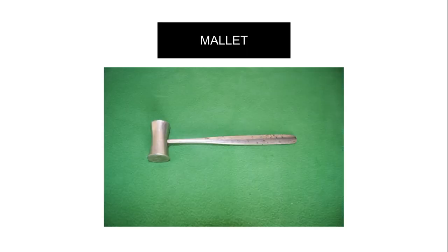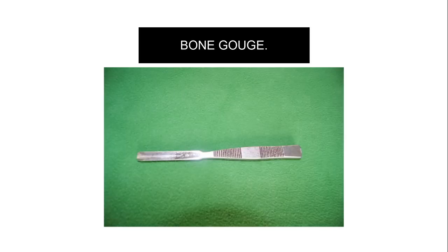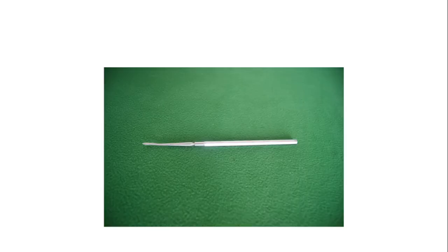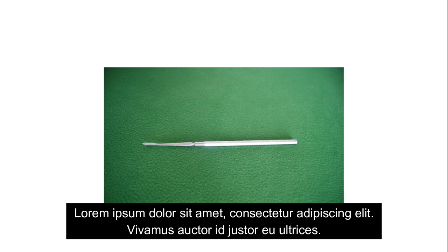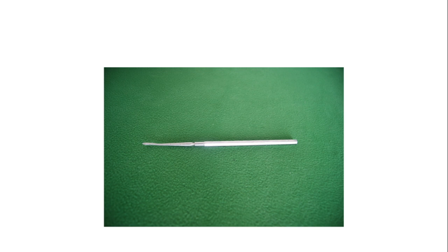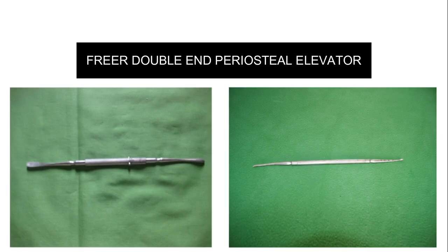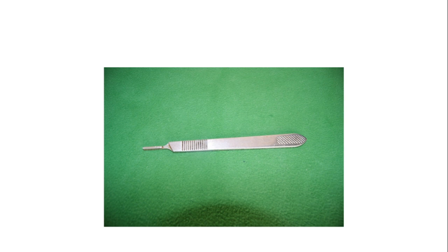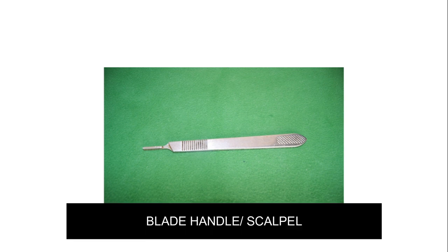This is the hammer and mallet — both are used together to remove bone. This is the septal chisel. This is the Freer periosteal elevator, used in elevation of the periosteum — for example in septoplasty. This is the double-ended Freer periosteal elevator. This is the blade handle — also called the scalpel — with the blade, used for making incisions in surgery.